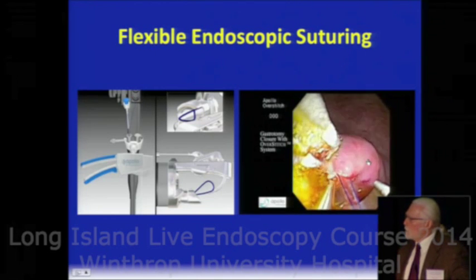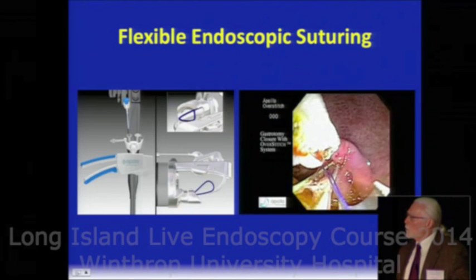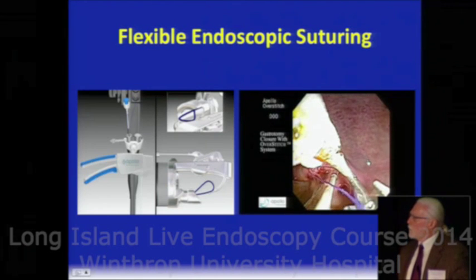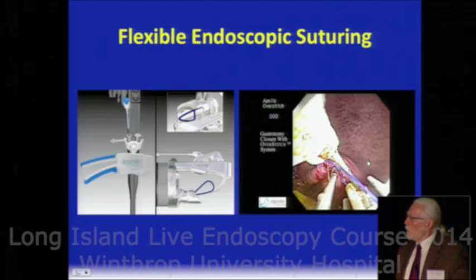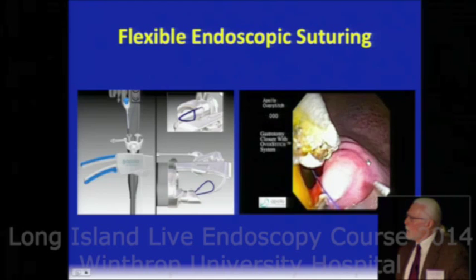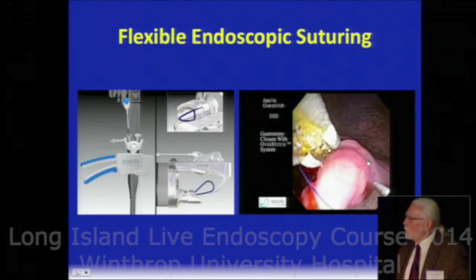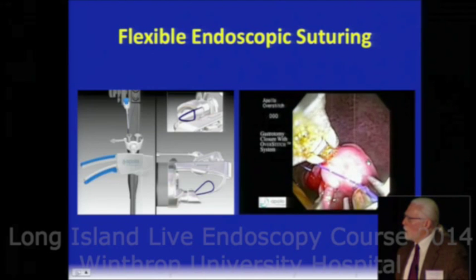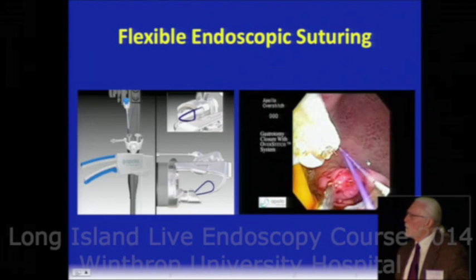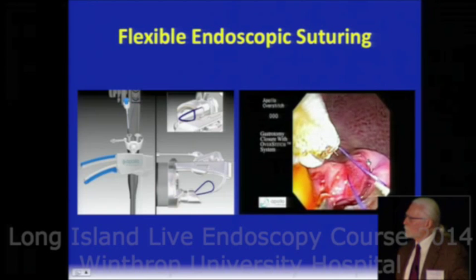So stitches are placed using the curved function of the needle. In this particular example, we're using a grasping forceps, but we also have a screw-type helix device that will grasp the wall of the gut full thickness and bring it up into the jaws of the suturing device. So what I want you to focus on again is not only just the sutures being placed, it can look kind of confusing, but there's a transfer going on right here where the needle tip with the suture is grasped, taken off of that curved arm as it's retracted and gotten ready for the next stitch to be placed.